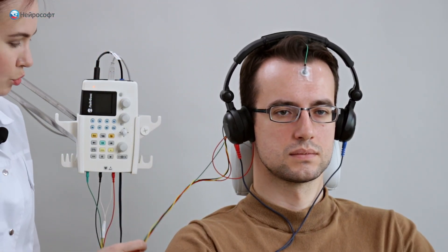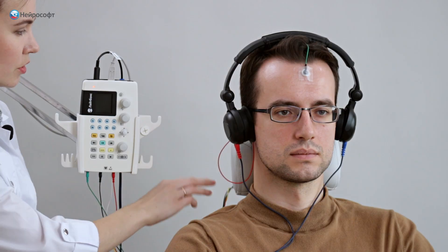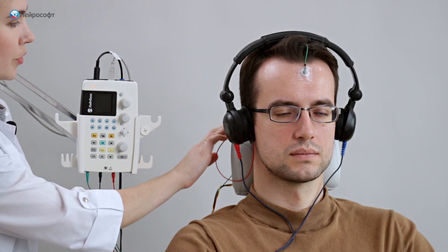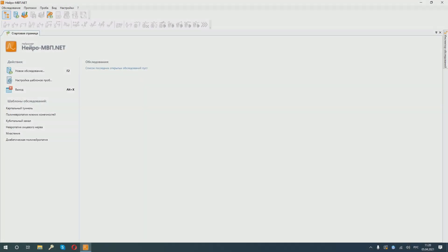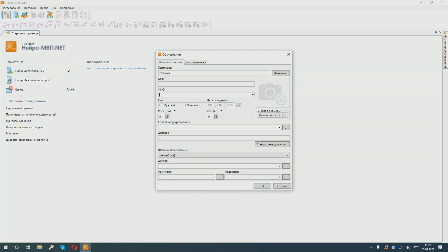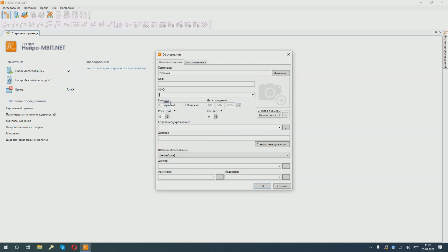Electrode cables should be intertwined to minimize interference. We can proceed to work in the program. We are in the main window of the NeuroMEP.net program. Create a new examination. Enter patient's data. Date of birth. You can enter related information if necessary. When you have finished entering data, click OK.